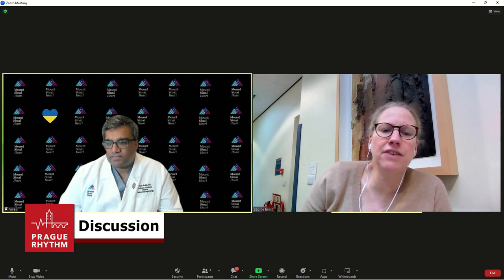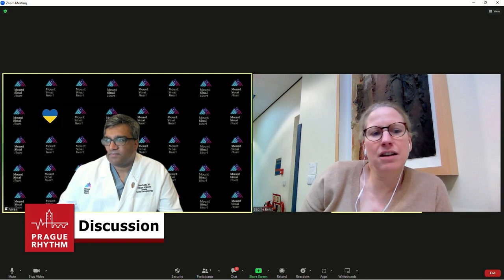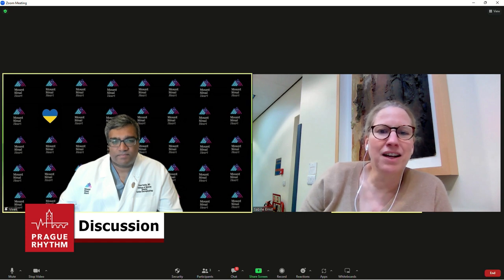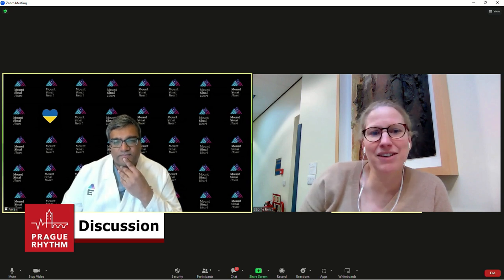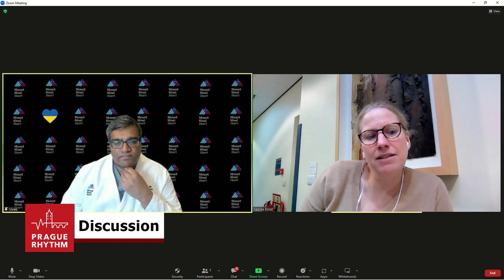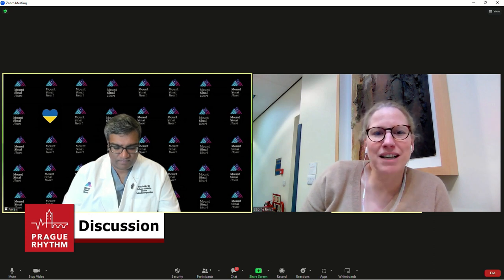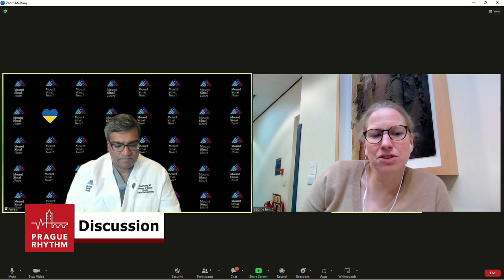If you think about why interventional cardiologists have not taken up the single shot devices in greater numbers, as was predicted, that cryoballoons or any single shot would be in the hands of non-EP doctors and help us solve the epidemic of AF patients hitting us. We're under-treating. There are so many more patients than we can treat. And the problem that I see is training people in transseptal punctures and doing that safely. But they're already three quarters of the way to the left atrium, right? If we would manage to get them into the left atrium from a radial approach, we would take all of the expertise and just get them into the left atrium.